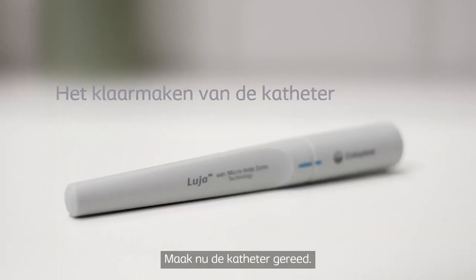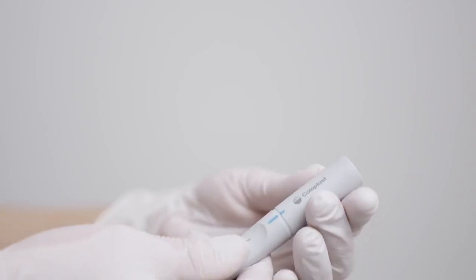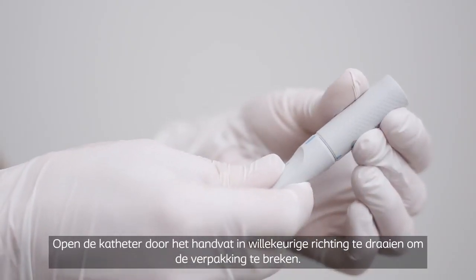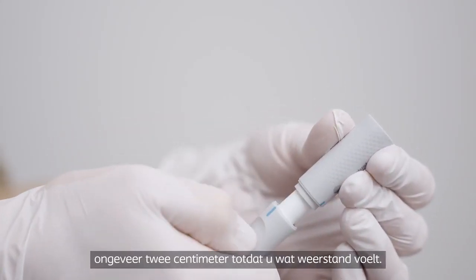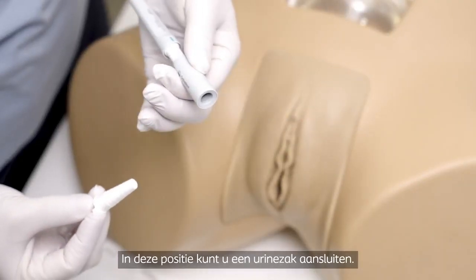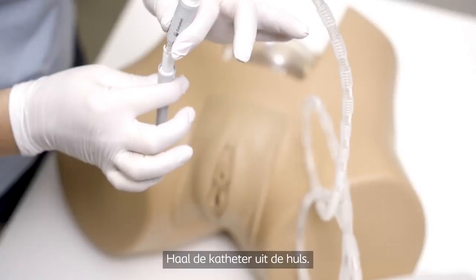Now prepare the catheter. Hold the catheter with the handle pointing upwards. Open the catheter by turning the handle in either direction to break the packaging. Gently pull the handle upwards approximately 2 cm until you feel some resistance. In this position, you can connect a urine bag. Pull the catheter out of the container.